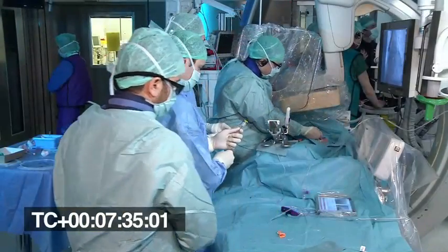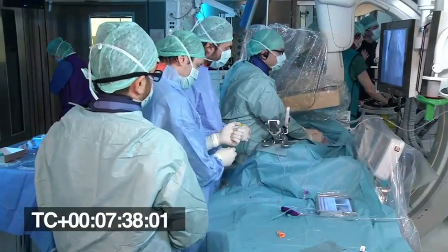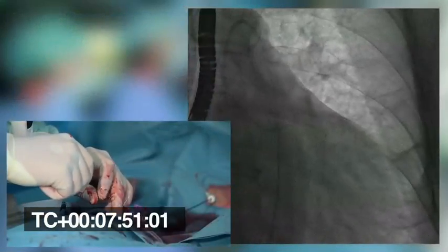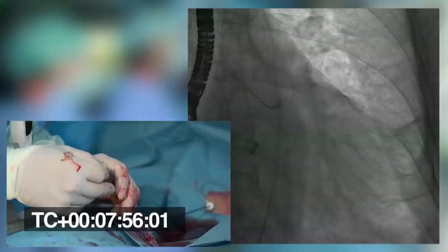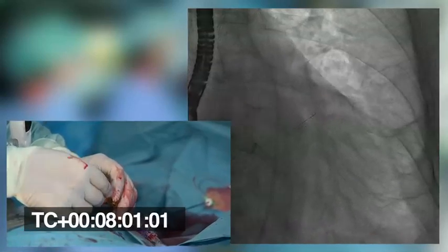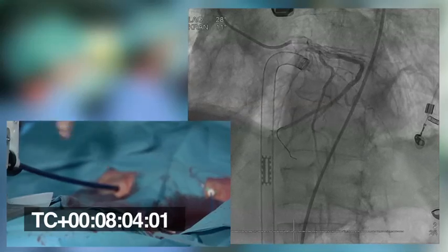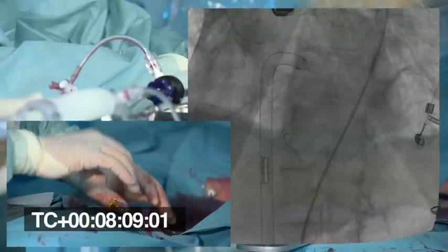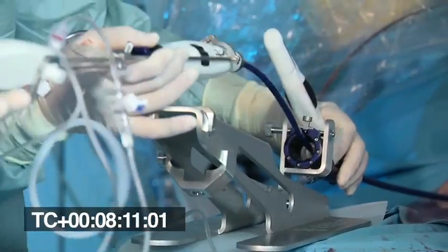So the next step: in this particular case we will put a guide wire into the left circumflex artery because of this specific anatomy. We have to leave a wire in the circumflex because the circumflex is super dominant — the left coronary is super dominant. This will be just done in this particular case before advancing the catheter into the ventricle.